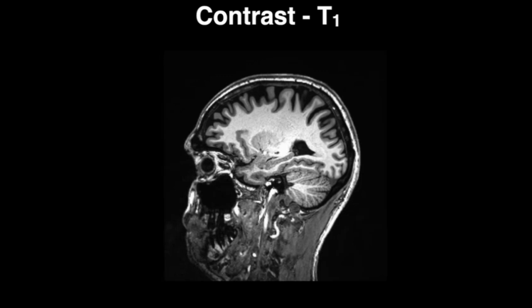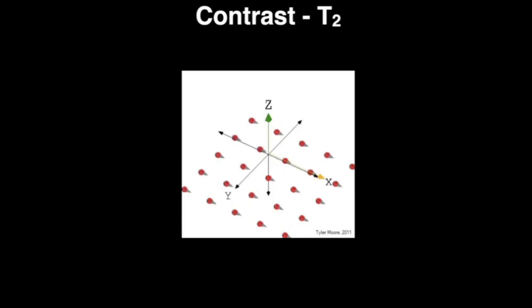The next, very basic type of contrast is what we call T2. Where that comes from is the fact that the magnetization we're detecting turns out to be an aggregate of all the protons in your pool that you've excited and are detecting. So remember, all of these are atomic species, nuclear species. So the magnetization that they have is very, very minuscule.